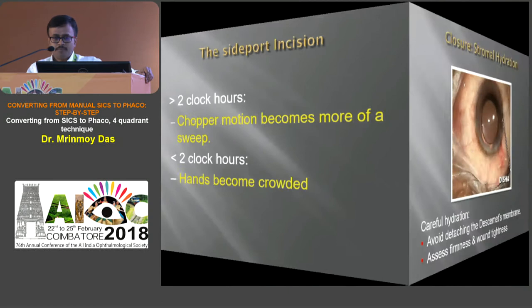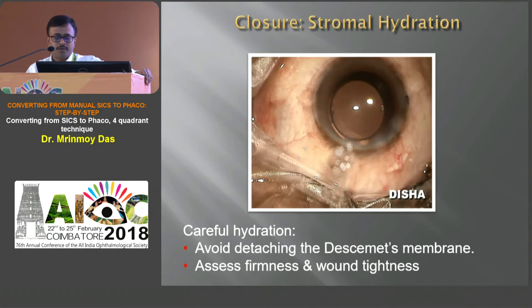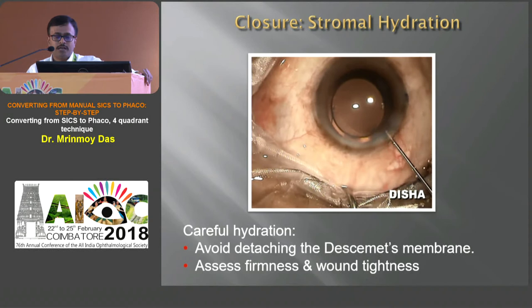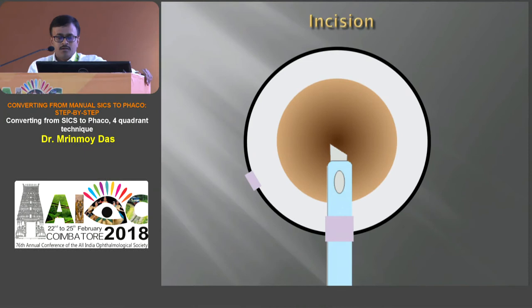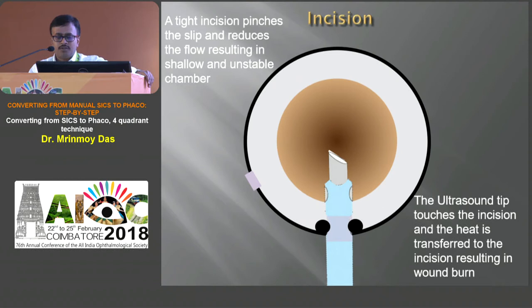After completion of cataract surgery, stromal hydration is needed to seal the entry chamber watertight. During stromal hydration, take care there should not be any Descemet detachment. Always assess firmness and wound tightness at the end. A snugly fitting phaco probe and incision gives a stable anterior chamber. But if a tight incision pinches the sleeve and reduces the flow, resulting in a shallow and unstable chamber — and if the ultrasound tip touches the incision, heat is transferred directly to the incision, resulting in wound burn.